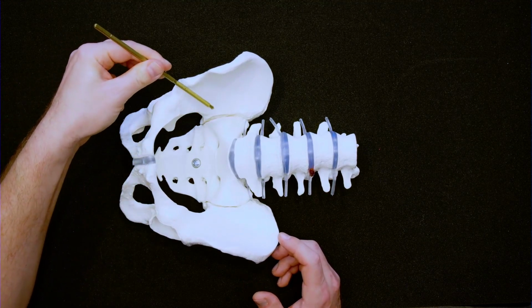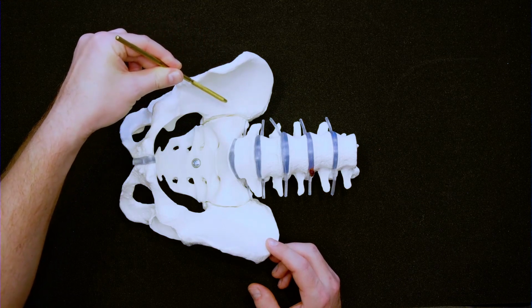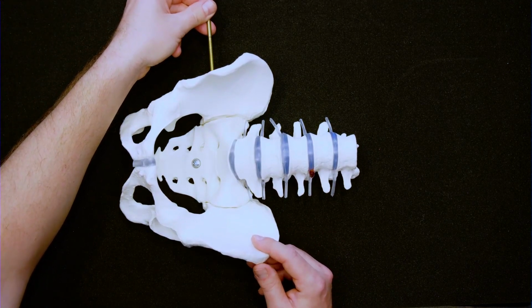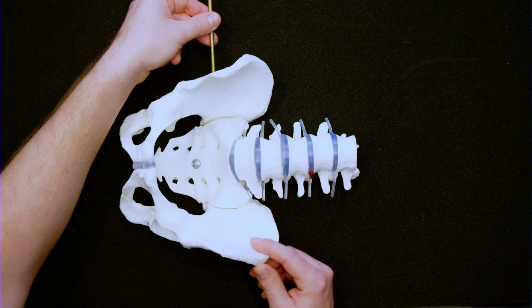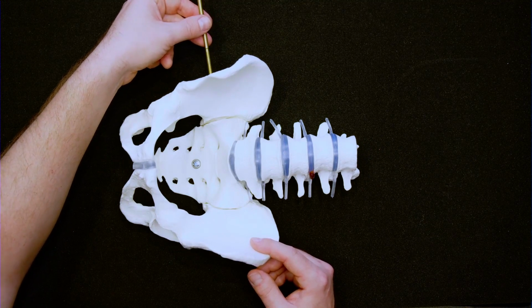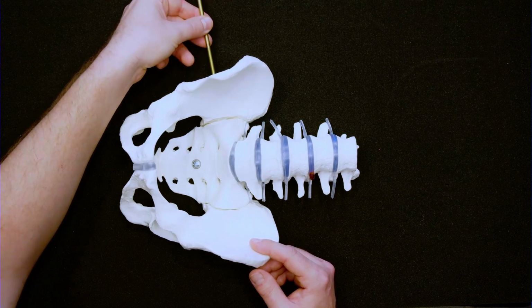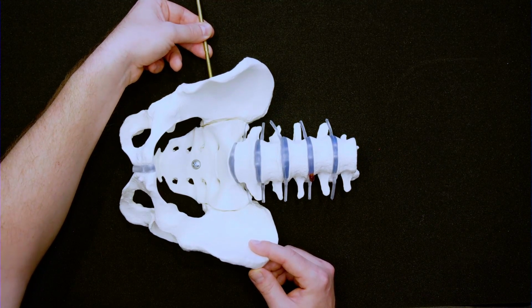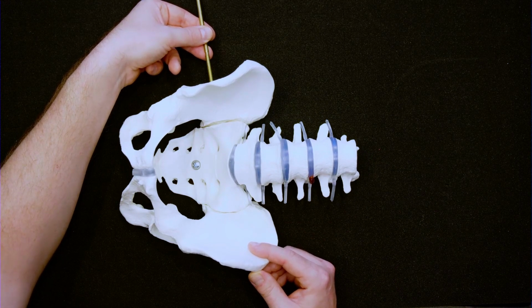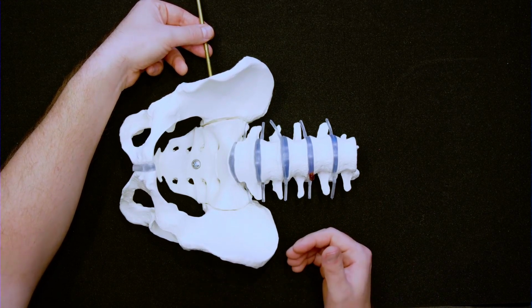We can also access the supraacetabular corridor or an iliac wing corridor from there. Additionally, it's easy to address an SI joint, especially S1, in this position. However, it's getting more and more challenging if you have a very dysmorphic sacrum and you have to go deeper with your screw and your screwdriver, so usually the table hinders you from placing your screw. In these cases, you have to think first and go for positioning second.